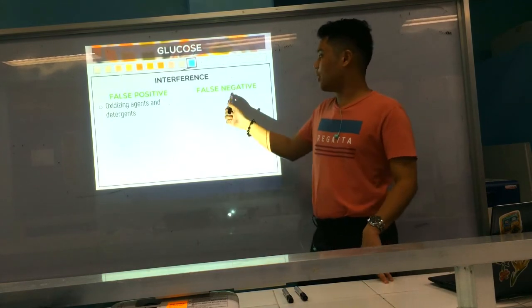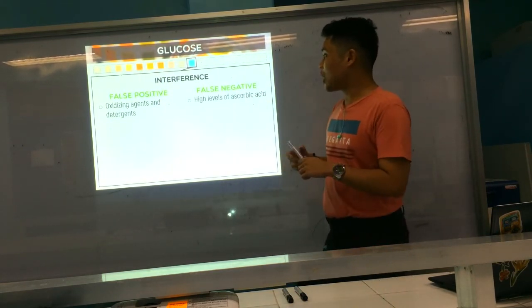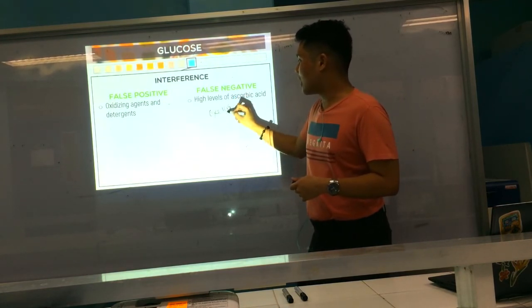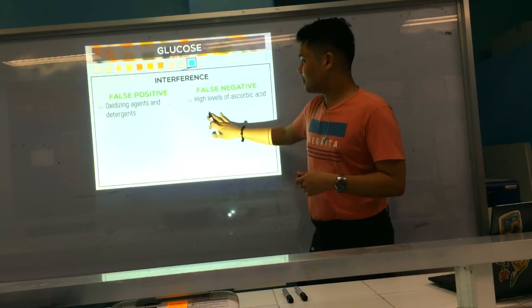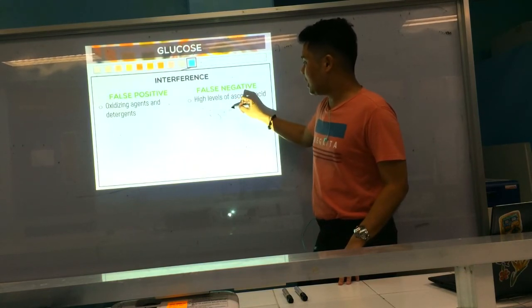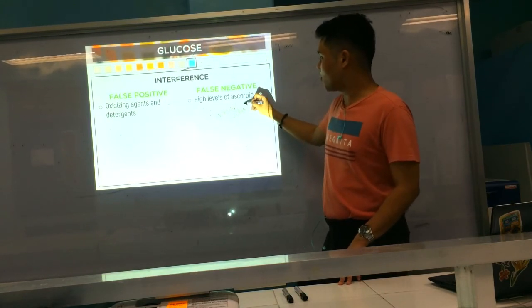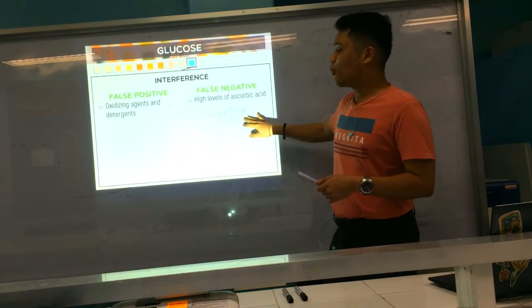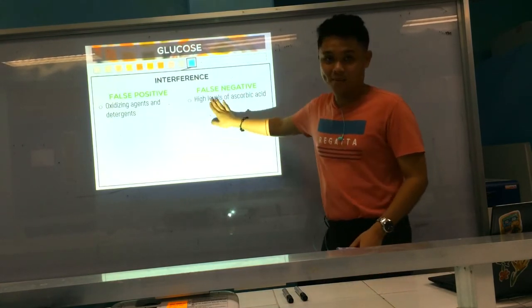For false negatives, high levels of ascorbic acid are a cause. Ascorbic acid is a reducing agent — the opposite of an oxidizing agent. Therefore, it cancels out glucose oxidase, preventing it from working. Hence, no reaction takes place and the result is a false negative.